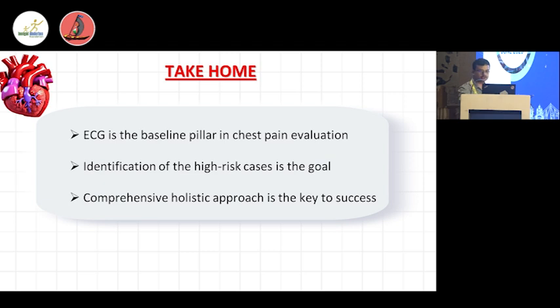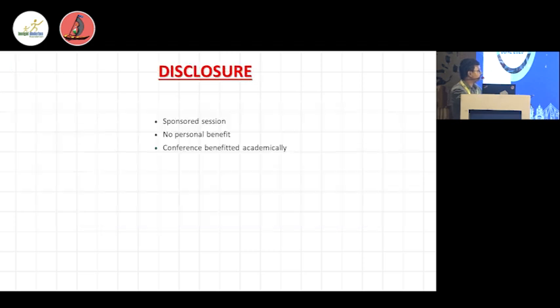At this level, we should also know what is the ischemic T inversion and the LVH strain-related T inversion. In the ischemic T, the T wave inversion is mostly symmetric, whereas in LVH strain pattern, you will get the LVH pattern in the ECG along with asymmetric T. The classical apical HCM also has a deep T. Again, it is mostly an LVH strain kind, not ischemic kind.